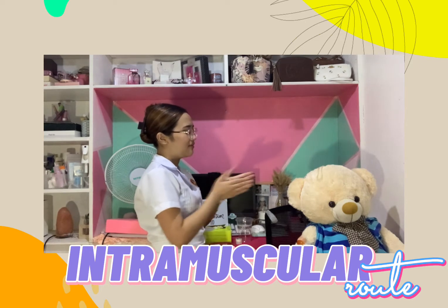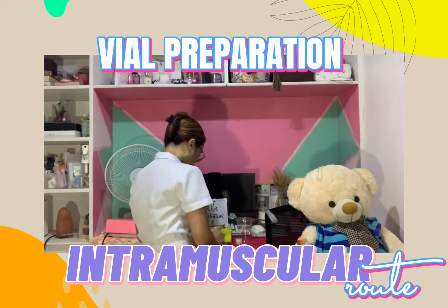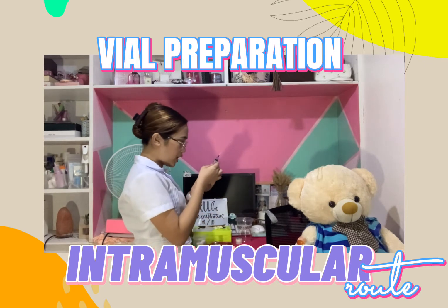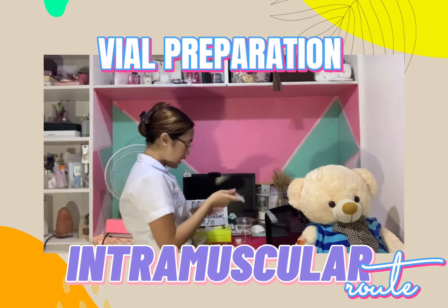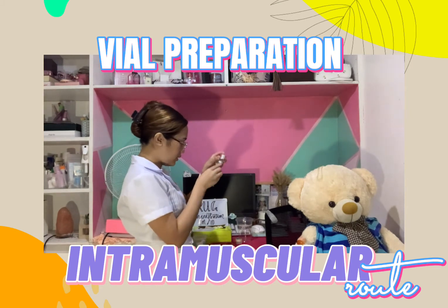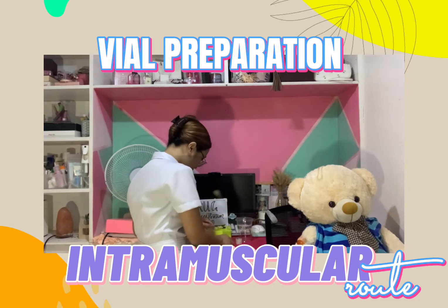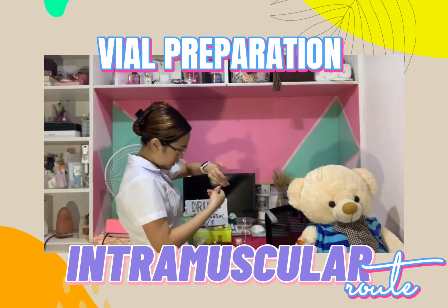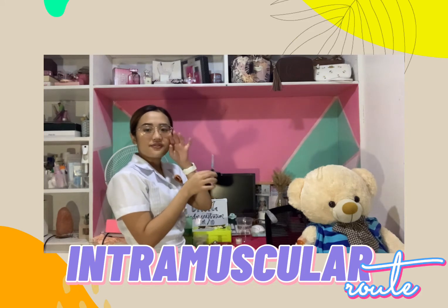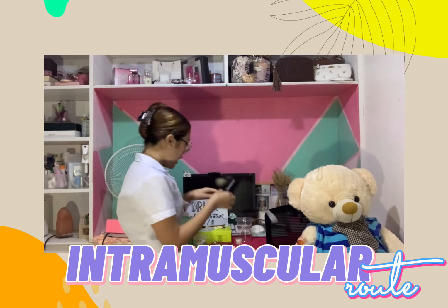So we will perform the vial preparation. After the preparation, we will label the syringe with the 5 rights of the medication.